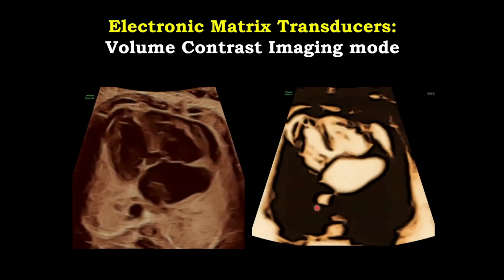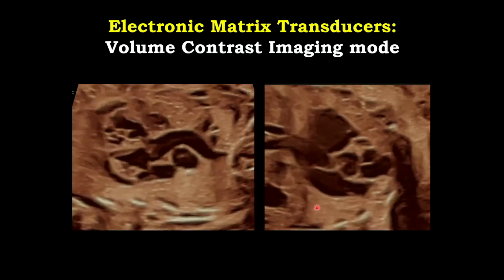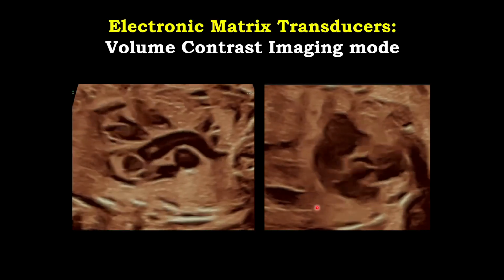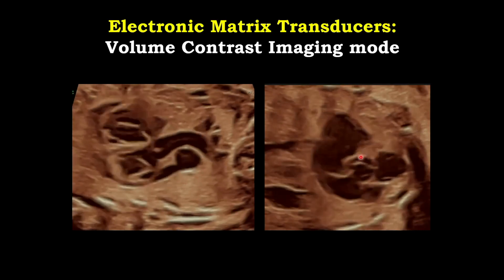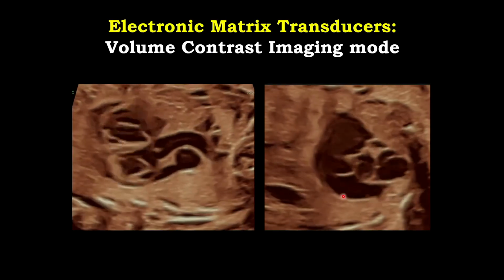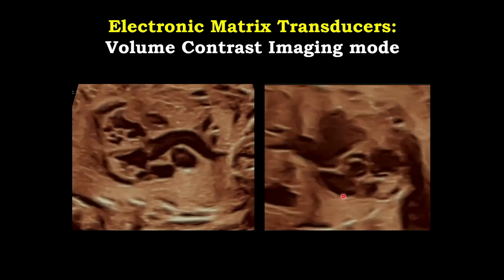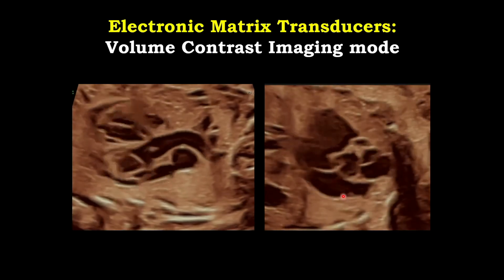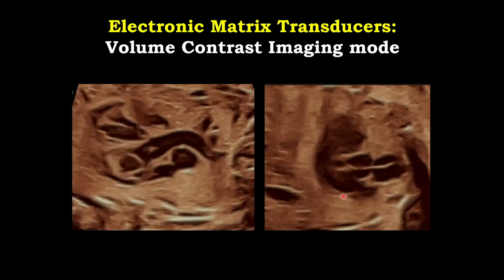You can use the inversion mode as well. Again, it's very easy. And a very tiny and very accurate diagnosis of anomalies such as the bicuspid aortic valve would not make any problem for you, because you can really see how easily it's diagnosed when you have that improved contrast resolution. So I would attract your attention to explore those technologies, especially taking advantage of the technologies being next door.